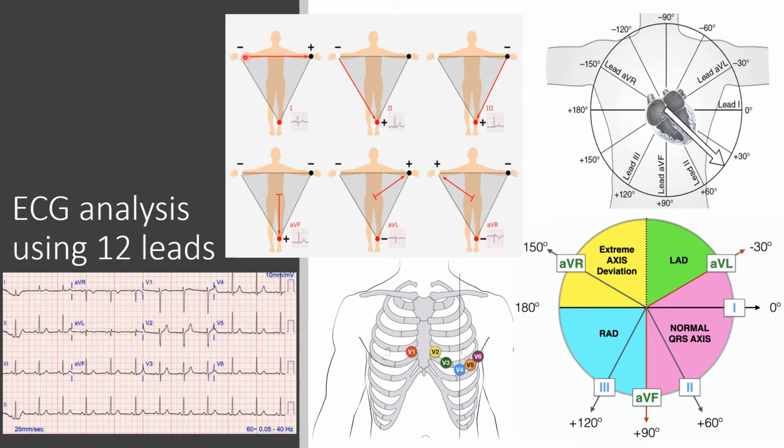So if you're going to put a negative electrode on your right wrist, then put the positive electrode on your left wrist. So if you're going to go with wrists, then go ahead and use your wrists. If you're going to use shoulders, etc., just make sure that when you place those electrodes on the skin, you are being consistent in how you are placing them. And this is a very non-invasive technique.